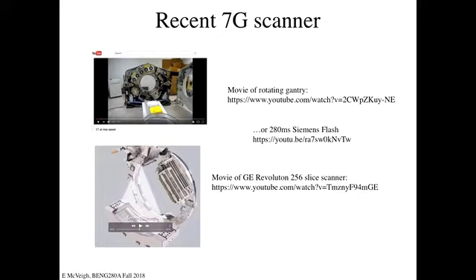So one of the engineering criteria for these new CT scanners was to try and get the noise down of this rotation, because it's a little disconcerting when you hear the thing going faster and faster and the frequencies get higher and higher and the patient's in there going, what the heck? And you remember that EKG monitor? You can see their heart rate start to go up, right, as the noise goes up, and you're like, oh no, calm down, everything's cool, right?